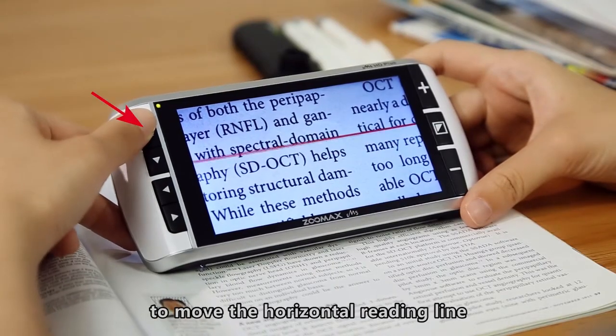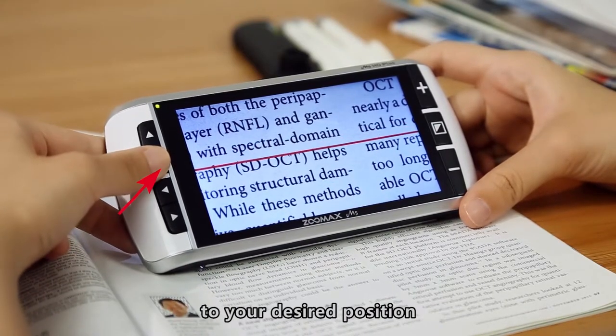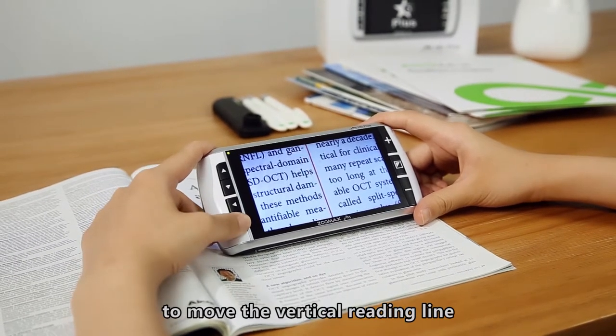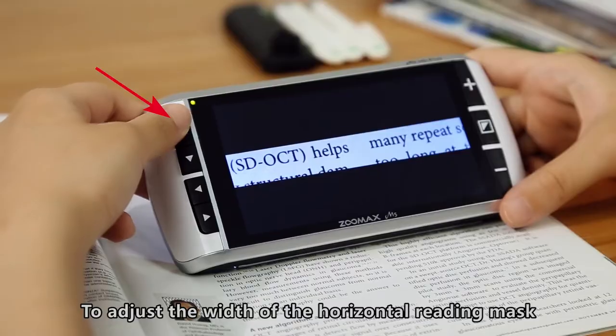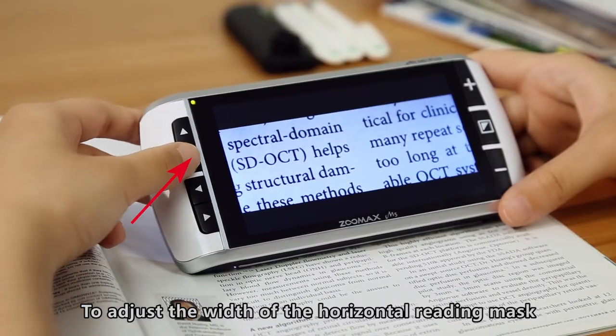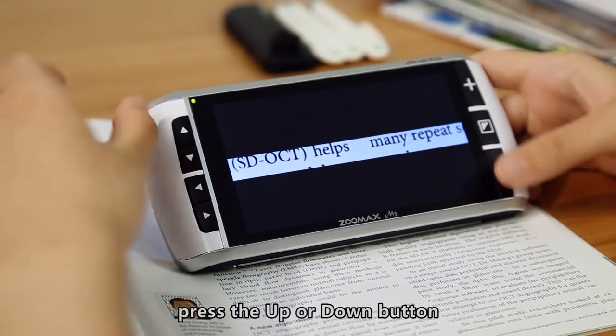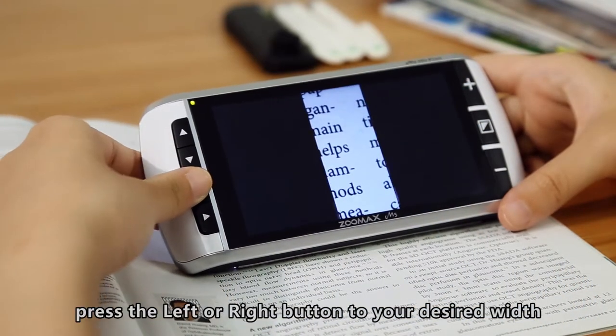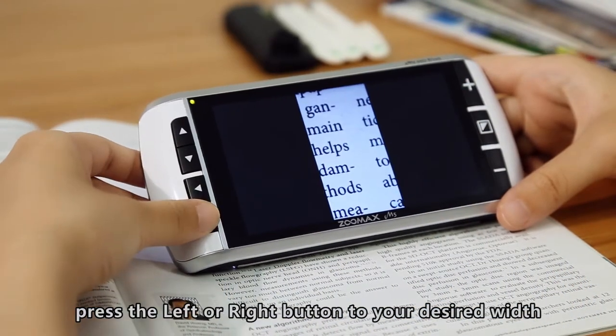Press the Up or Down button to move the horizontal reading line to your desired position. Press the left or right button to move the vertical reading line to the desired position. To adjust the width of the horizontal reading mask, press the Up or Down button. To adjust the width of the vertical reading mask, press the left or right button to your desired width.